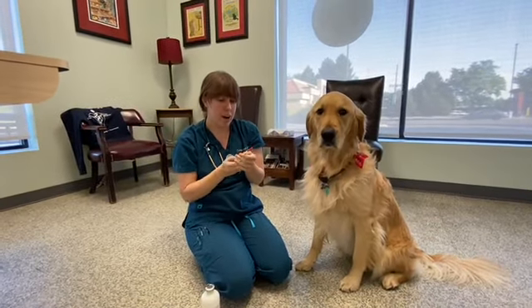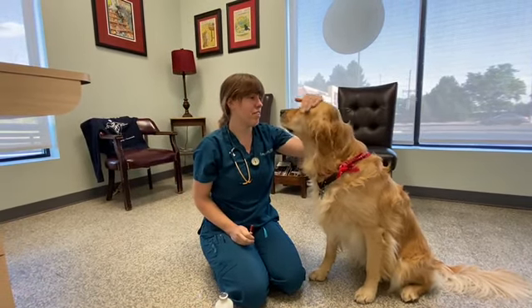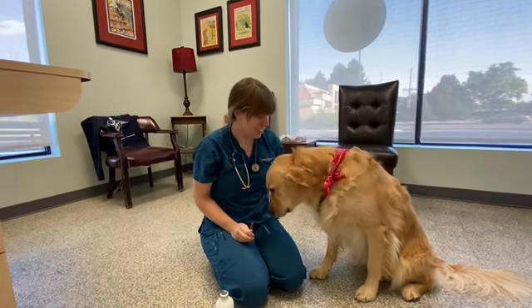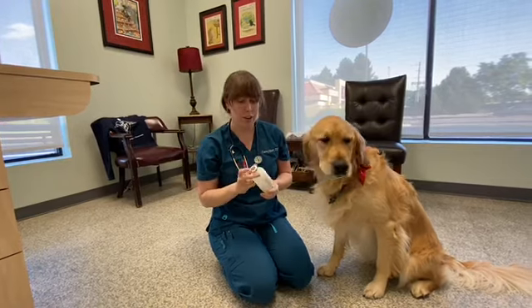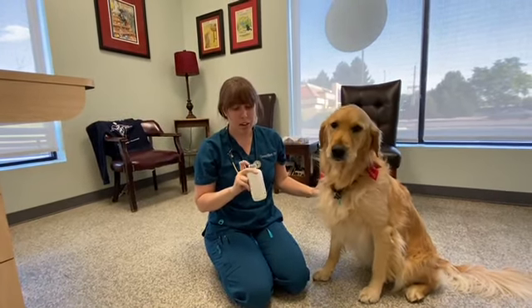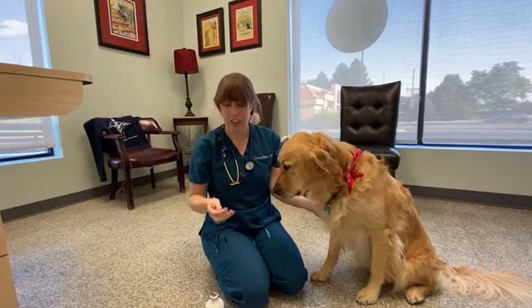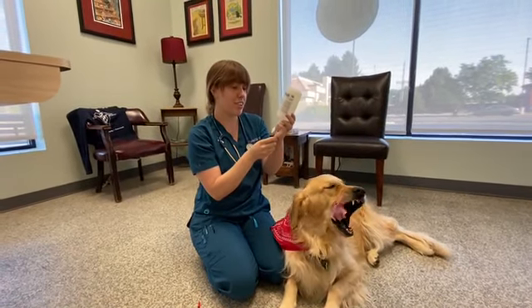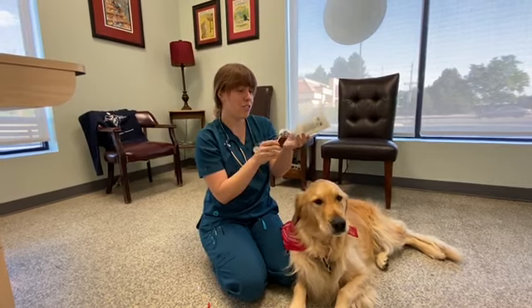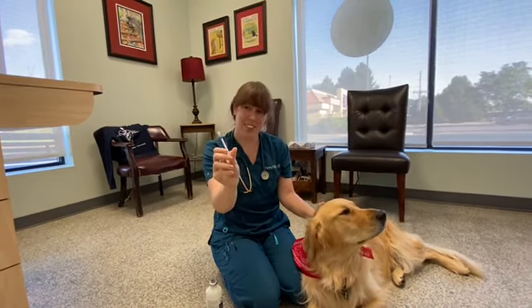For practice purposes, we're going to give our boy here just some saline under the skin, so this won't hurt him at all. On your insulin bottle — this is just a saline bottle — there'll be a part in the middle that has a little ring on it. That's the center of the bottle and that's where you want to poke. The needle comes attached on the side that says units. I'm going to give our buddy here a whole two units of insulin. You just push up and then pull down. This is really clear so it's difficult to tell that the saline is in there, but it's in there.